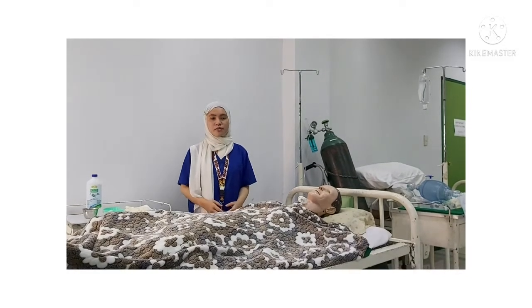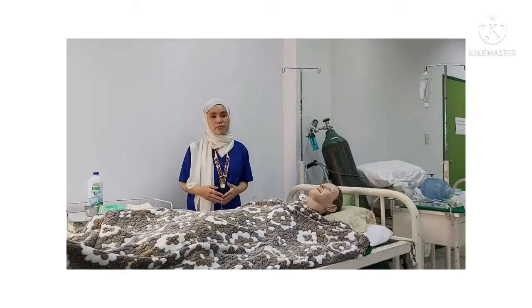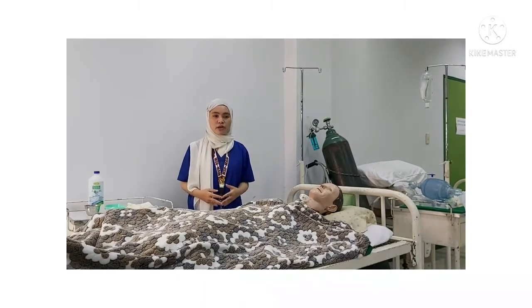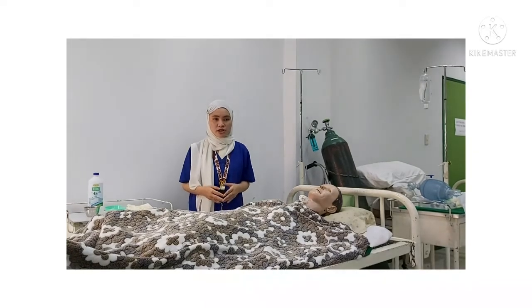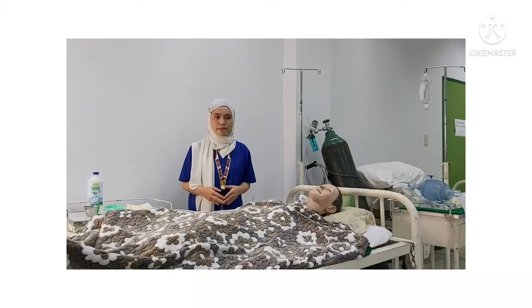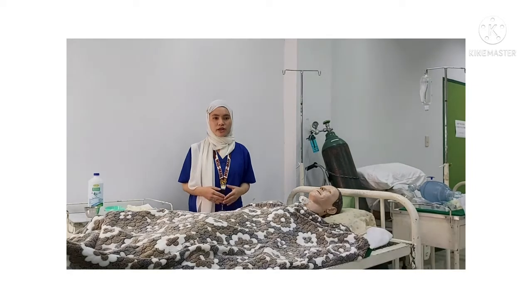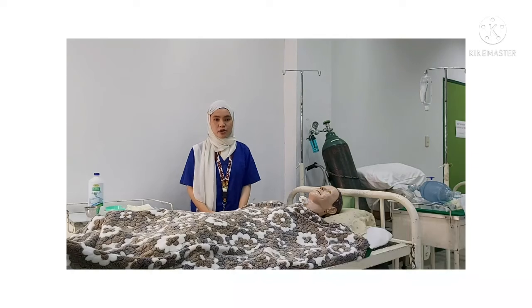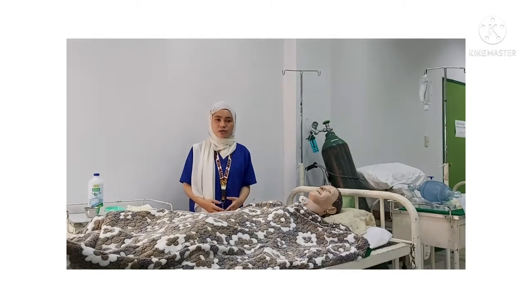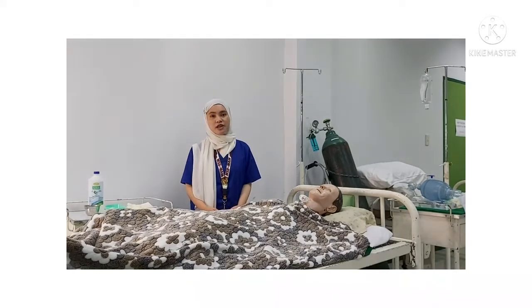So considerations before, during, and after the procedure are to introduce yourself to the patient, check the patient's respiratory status, and check the clinical condition of the patient and possible adverse events that may occur with suctioning. Things to document after the procedure are the procedure that was done, the findings, and also the observations that were gathered. So without further ado, let's start the procedure.